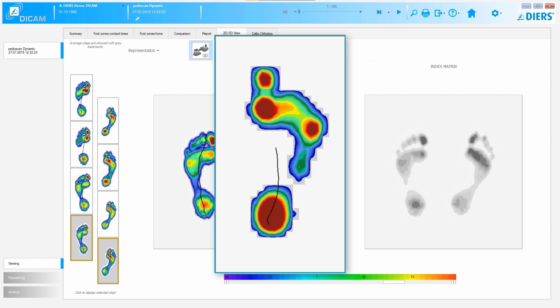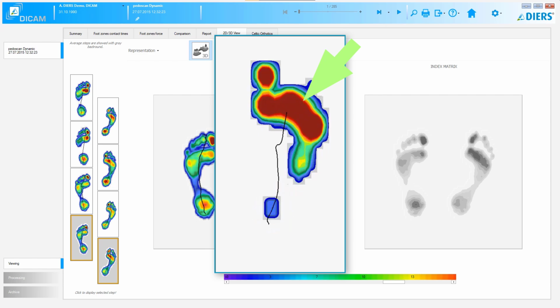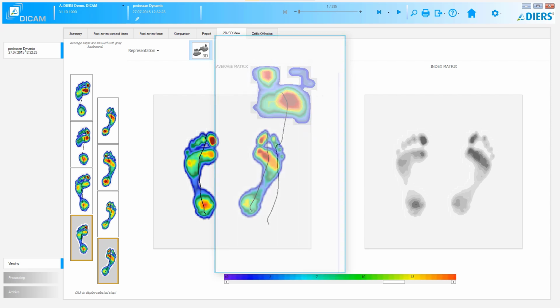At the moment when the body's center of gravity moves toward the forefoot, and the pressure in the metatarsal region increases, the anterior transverse arch should fulfill a bridging function that guides the COP from lateral to medial. A splay foot shows here either a much larger pressure region, which does not show dynamics following the COP, or separate pressure zones below the metatarsal heads. In the latter case, the metatarsal heads stand out separately but simultaneously, or appear as pressure berries in rapid succession.